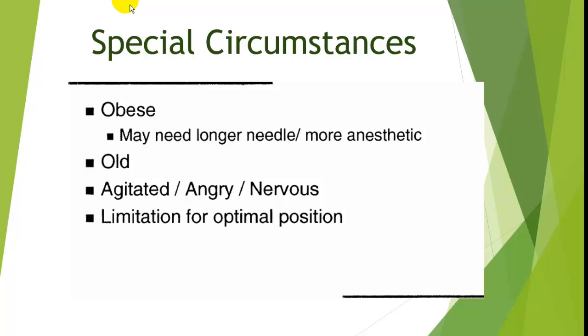Some situations may pose some challenges. If there is a particularly gravitationally challenged patient, you may actually need a longer needle in order to arrive at the interspace. Sometimes patients move when it's inopportune, and so they will require some sedation. And sometimes it's difficult to get them into the optimal position, but you will deal with those as they come.